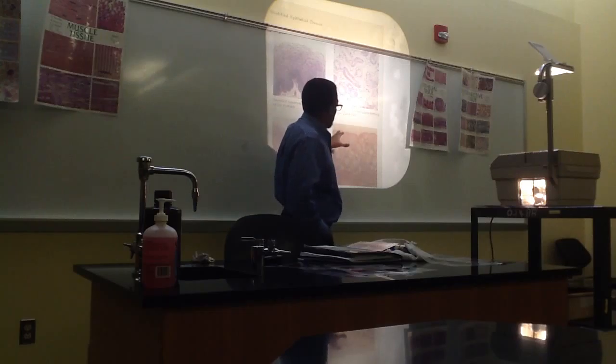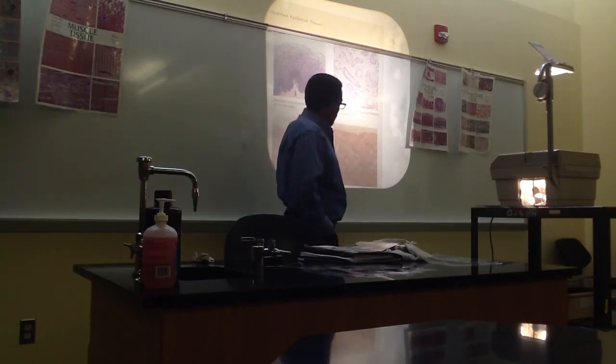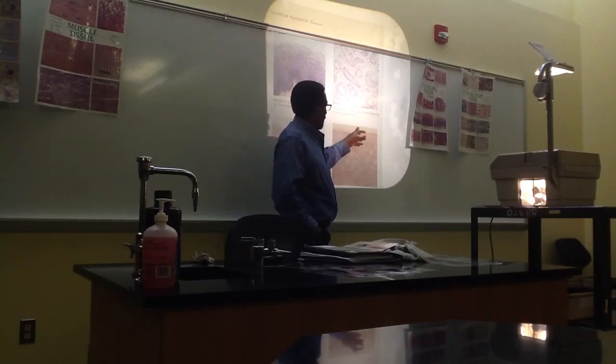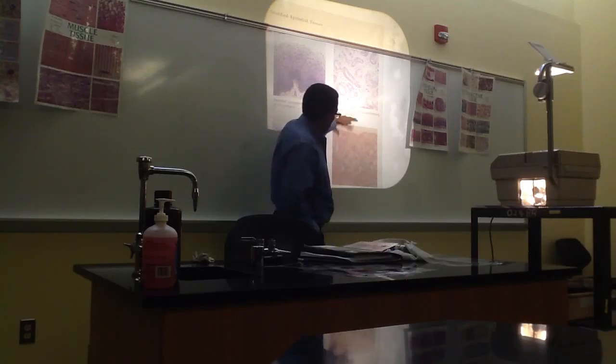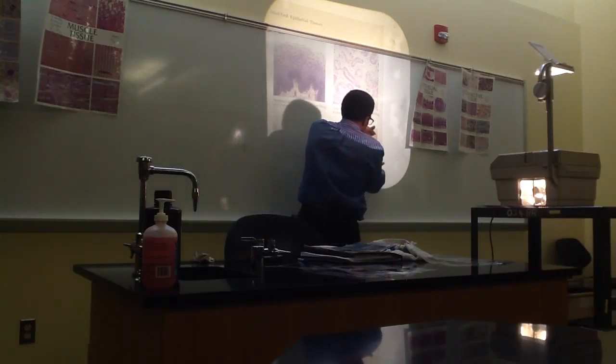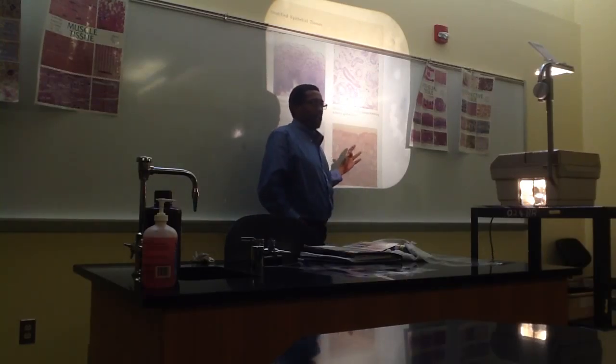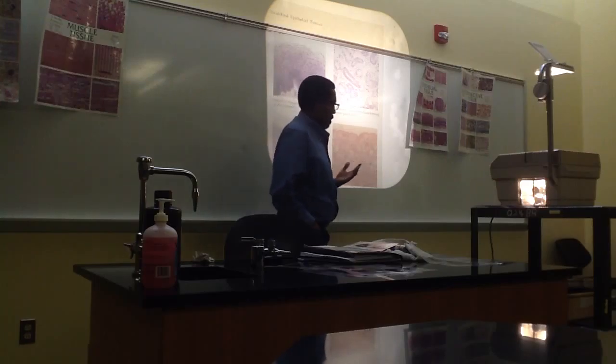Now, this will be a challenging tissue, but what I want you to notice are the very thick-looking cytoplasm on these cells near the free space. I should have asked you, what is this? The free space. All right, what kind of tissue is this next to the free space? Epithelial tissue. So this is some type of epithelium. And we won't confuse it with muscles or connective tissues that we have yet to learn. But this is our method.